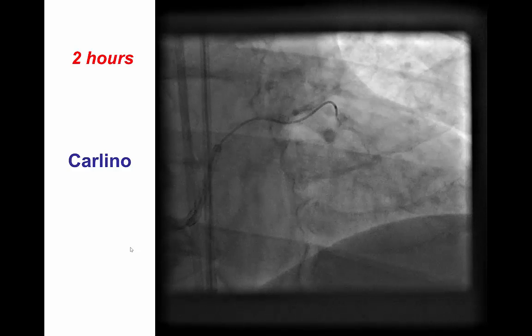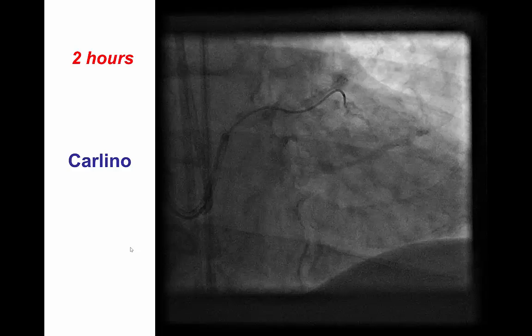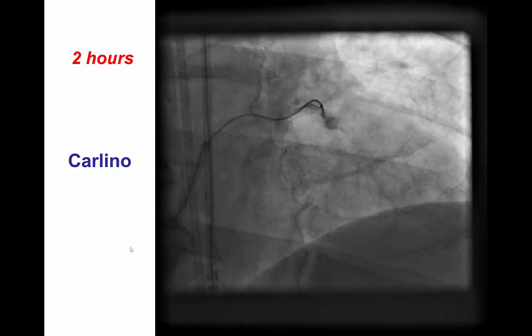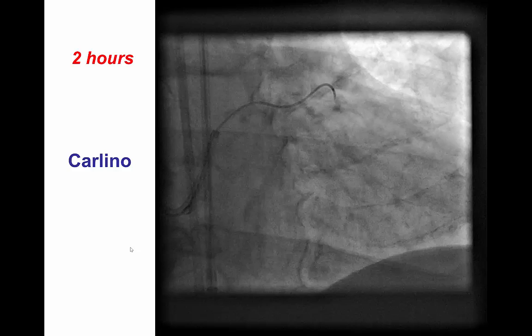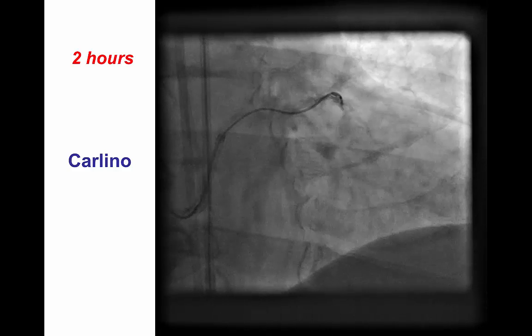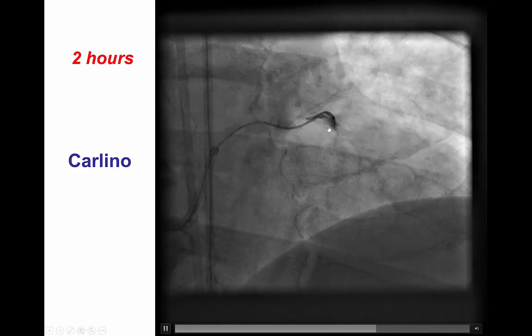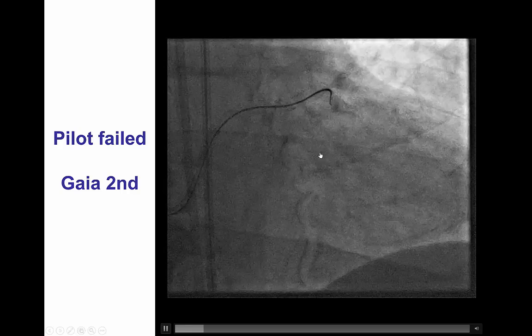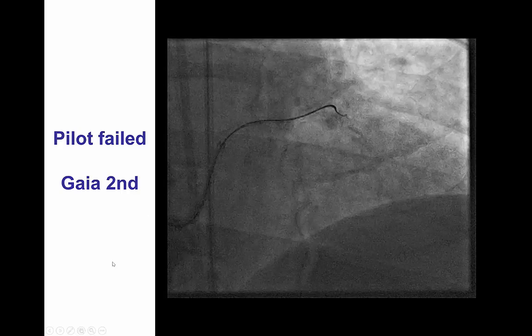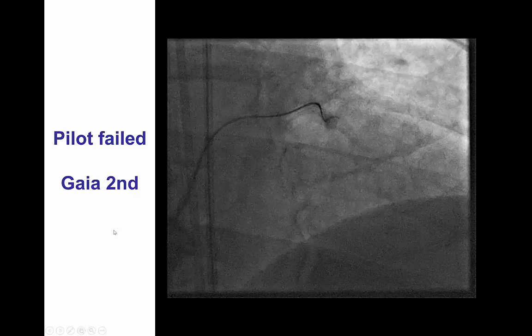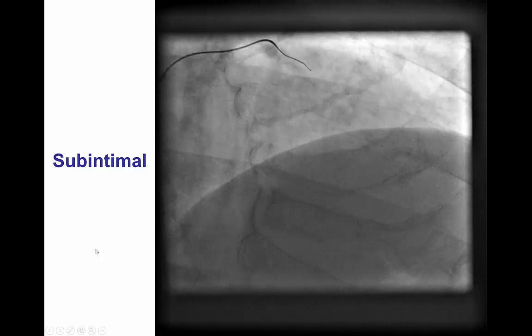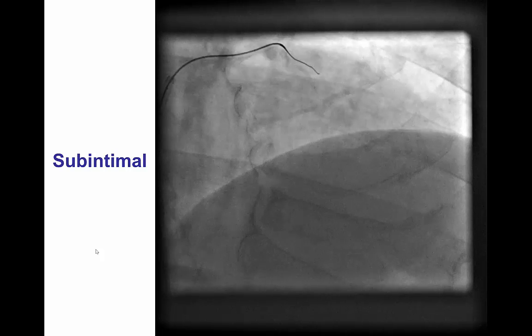After almost two hours of attempts, we still could not cross the lesion. We decided to completely change strategy — we pulled the wire back, advanced the microcatheter as far as possible, and performed the Carlino technique: administration of 0.5 cc of contrast through the microcatheter. This showed some contrast penetration into the distal true lumen. We then tried to cross with the Pilot 200, as the contrast can create a microchannel for the wire to follow. However, this did not work. The GAIA-2 wire did follow a plane, but contralateral injection demonstrated it was in the subintimal plane.